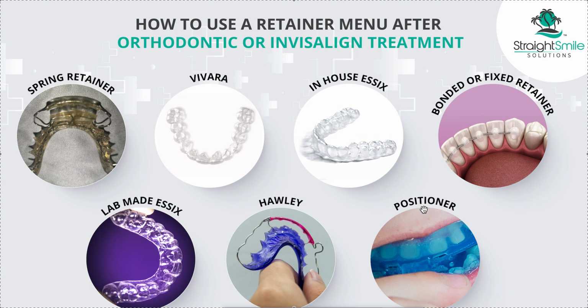But if you are a Healthy Start provider, their G is really great for mixed dentition. My only issue is that they do not generally offer it just as an a la carte single purchase. You have to buy the whole plan, which is very expensive. As much as I might not love their company and how it's run, I think it's a fabulous appliance for the mixed dentition when you finish phase 1 and go on to phase 2. It is, to be quite honest, my retention of choice. If they sold it individually at a reasonable price, they would probably get a lot more promotion and referrals from me, but they don't. And for other reasons, I don't send them that many people, but that's just me and them.